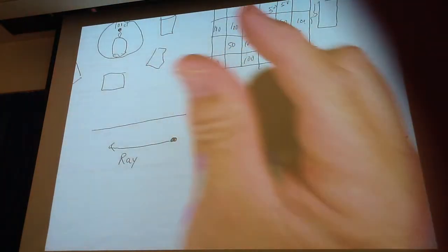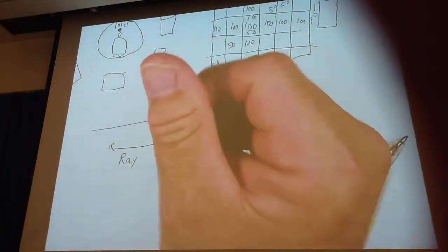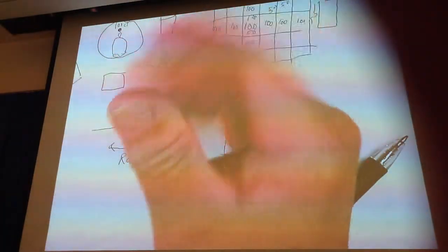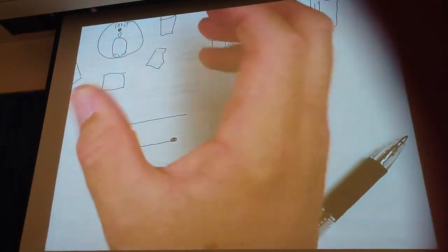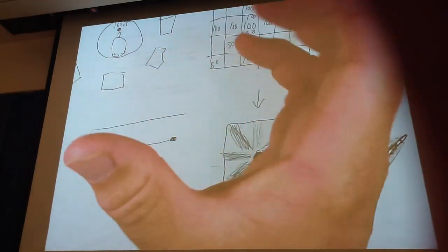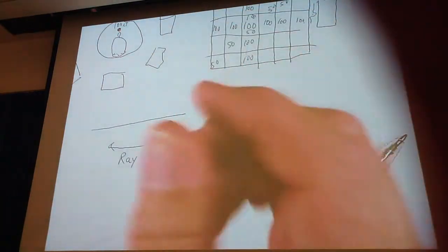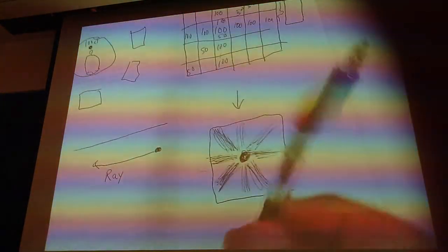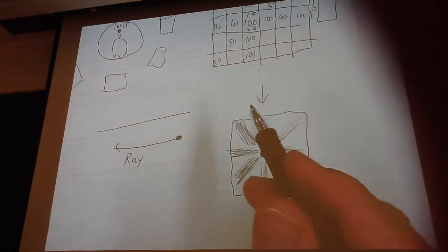So, you weren't able to measure the thickness of the muscle in the ventricles, you weren't able to really get a good idea of wall motion until we were able to just take a picture of end diastole and end systole. Because now I can say, this is how much motion the heart is actually producing during those two cycles. So gated acquisition is designed to improve the resolution of our studies.